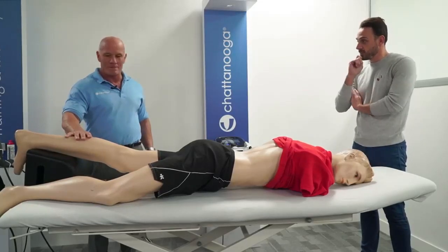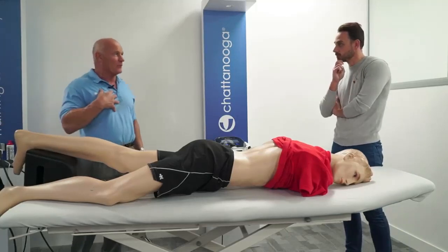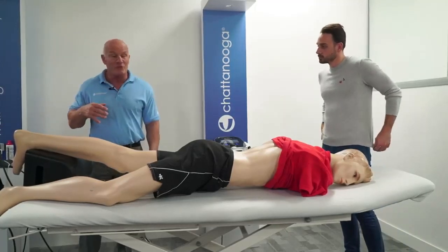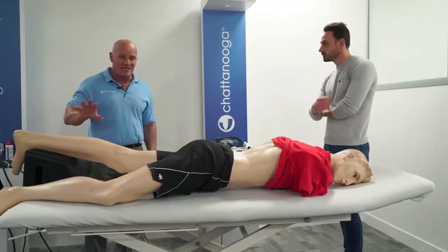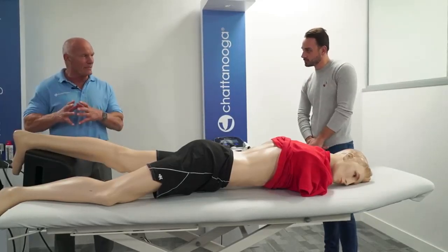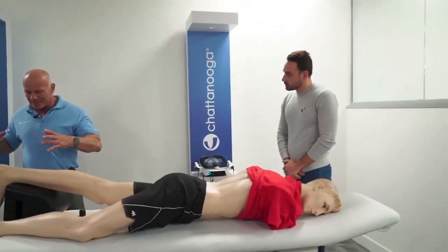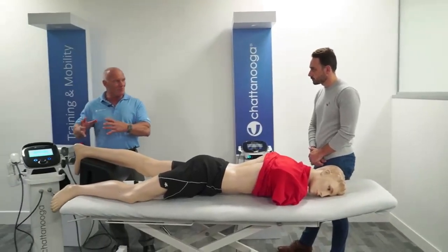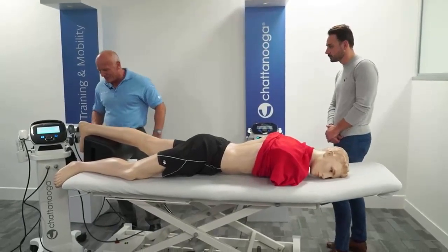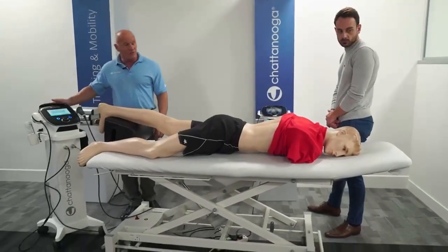Okay, well one of the things that I really love about this, because I work in London, and floor space is exceptionally expensive in London, is that we now have a much smaller footprint than we had with the other. And I know it sounds daft, but that's actually saving me money, because I've got additional floor space available. So that's great. I love the look.